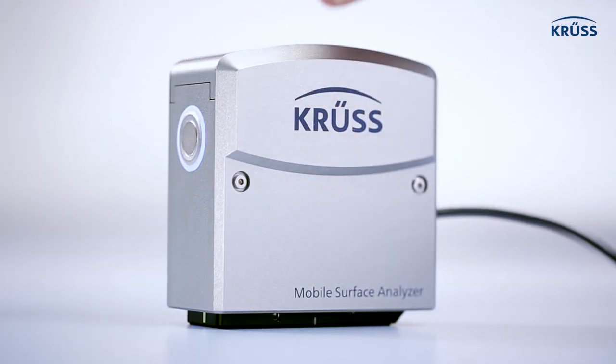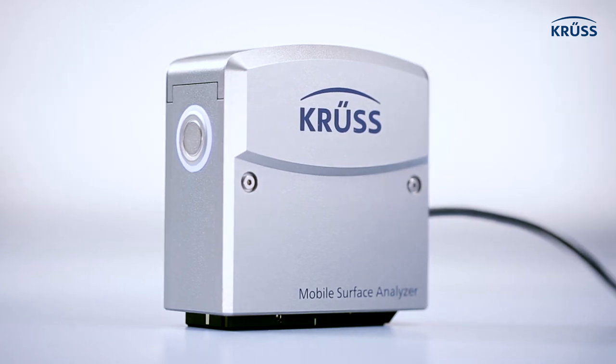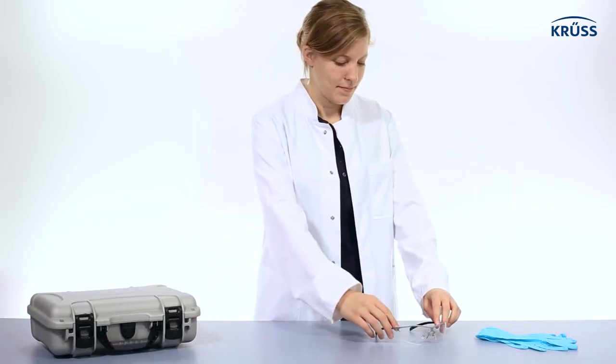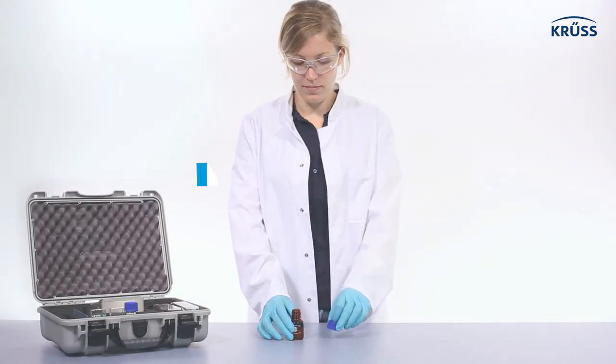You can refill the cartridges of your Mobile Surface Analyzer, MSA, with test liquids in five easy steps. Before you work with diiodomethane, put on safety glasses and gloves, and work in a well-ventilated area.